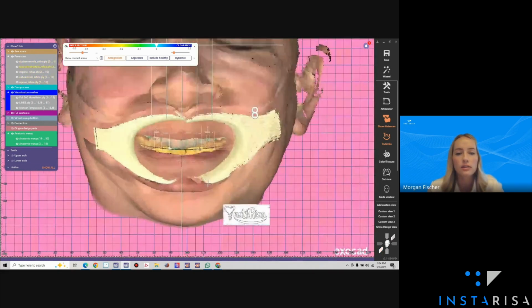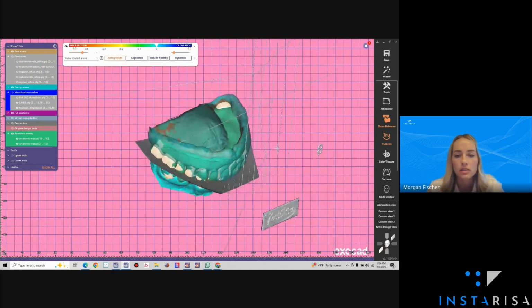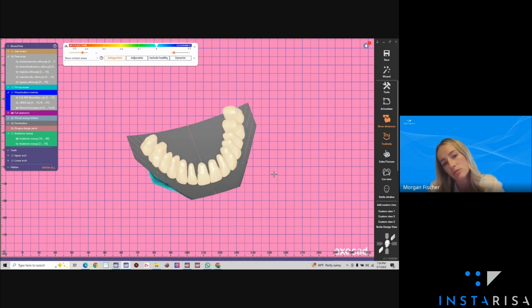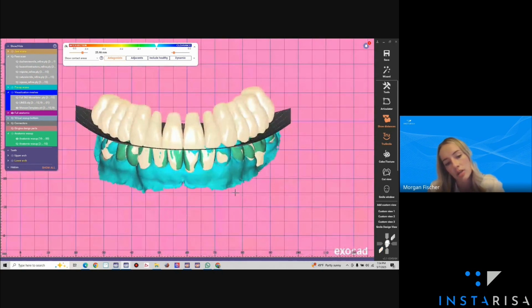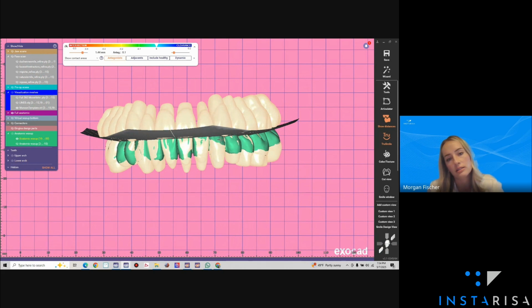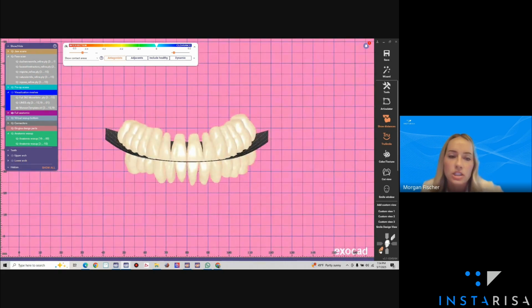And then another grid line that we have here is the curve of Monson, just to make sure that all of our cusps are occluding through this. Let's see if I can get it all on at the same time. Perfect. So this is just taking into consideration the curve of Wilson and the curve of Spee in the same plane, making sure that everything's functional.